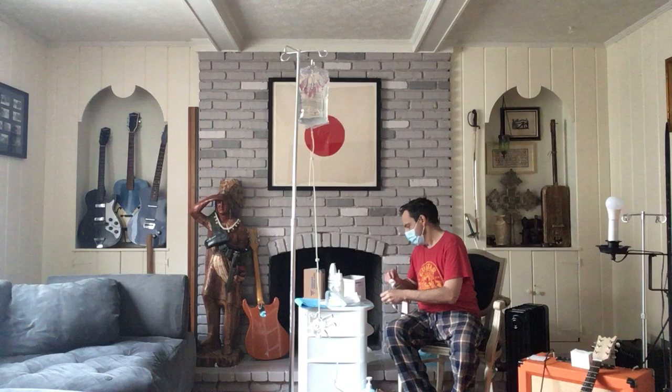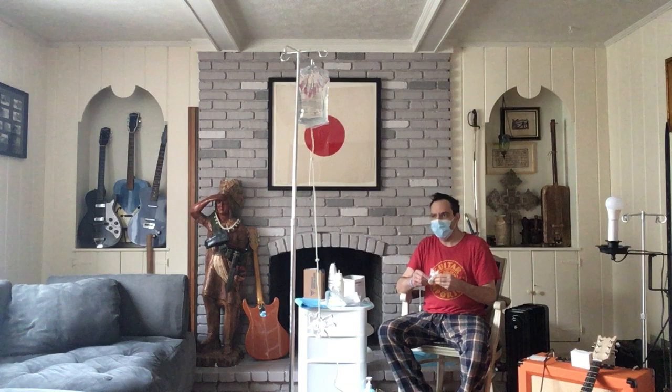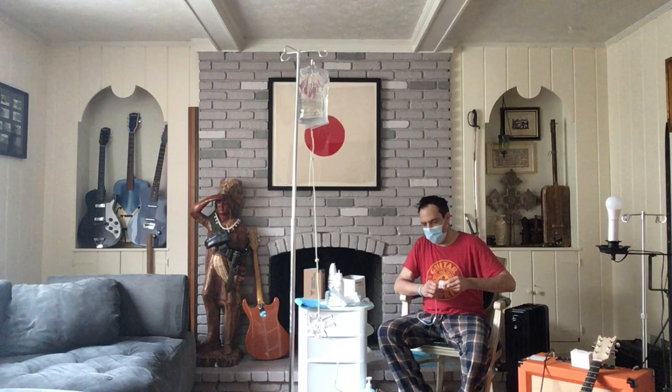Okay, and we're gonna wrap the tip of the peritoneal port up for a bit. Now, like I say, wrap it up for like 2 or 3 minutes. We're gonna wipe it down and make sure it's covered, make sure it's coated. All right, we're gonna make sure it's taken care of. But in training, they give you a certain amount of time because it's protocol. We're going to use, as my dad would say, common sense, which I have none of, to wipe this down.